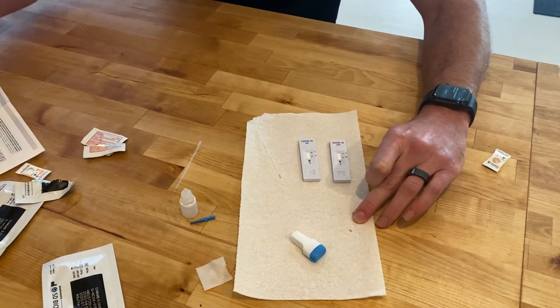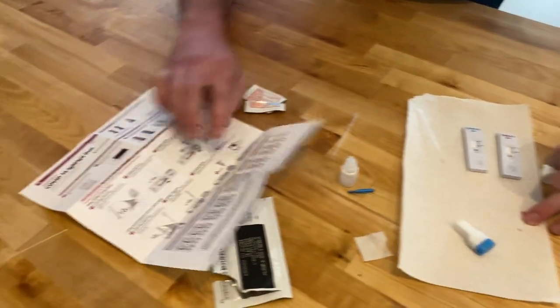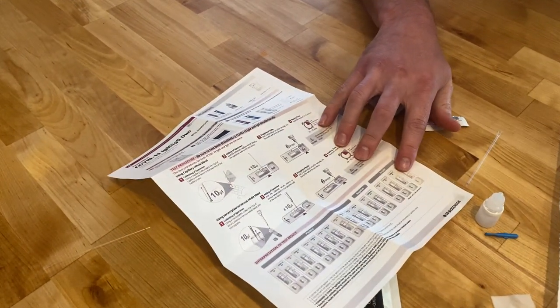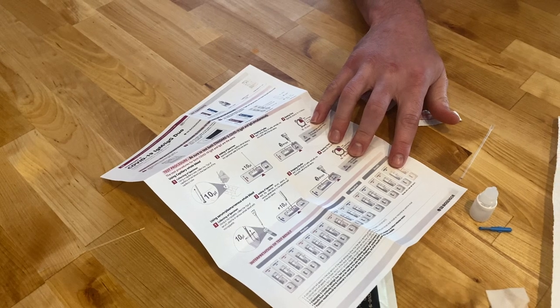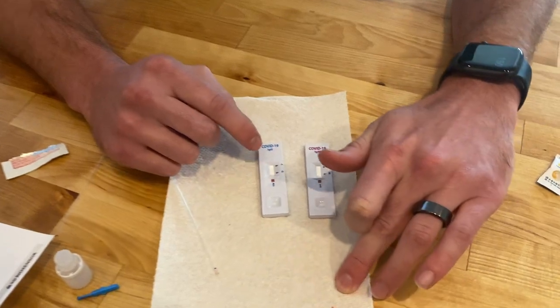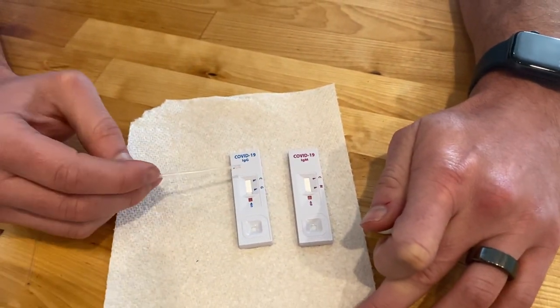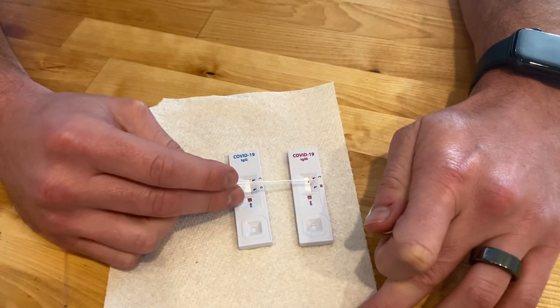Now you're going to be waiting. The instruction paper has the times for each step — 10 to 15 minutes. You can set a timer on your watch or phone. You're going to want to look for the control line to make sure the test is working. If the test is positive, you'll have a line at G or at M.